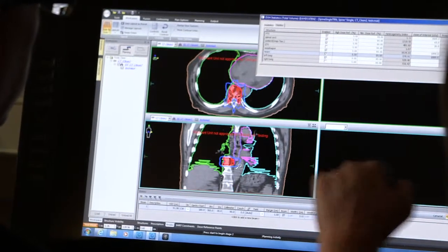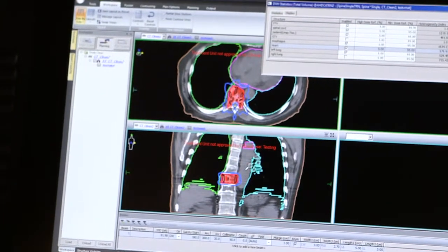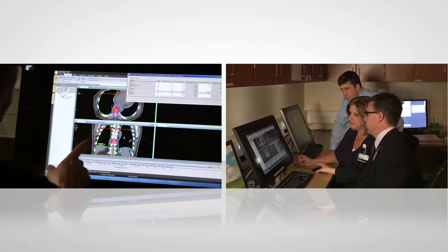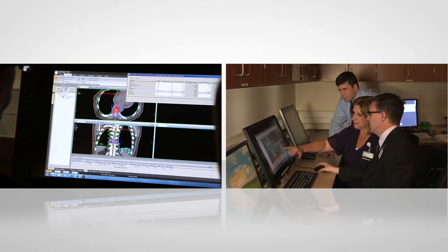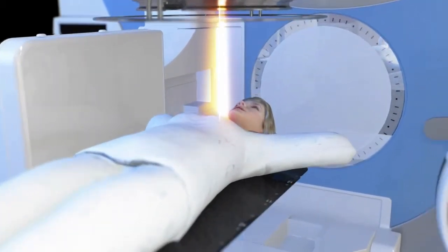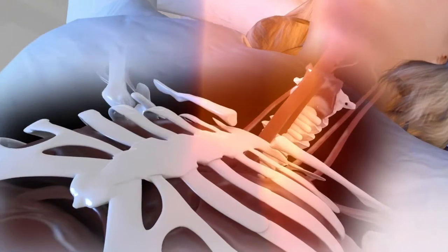Using sophisticated software, radiation treatment planning specialists can now calculate the exact details of your prescribed radiation treatment delivery. These planning specialists, a medical physicist and a radiation dosimetrist, work together to plan the intensity, shape, and path of the radiation beams. Their treatment delivery plan maps the way for the radiation to most accurately and effectively treat the tumor, while sparing as much as possible of the surrounding healthy tissue, organs, and critical structures, such as your optic nerve or spinal cord.